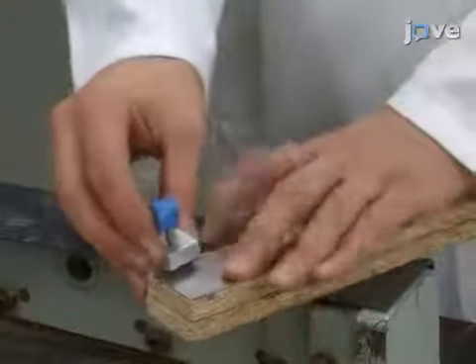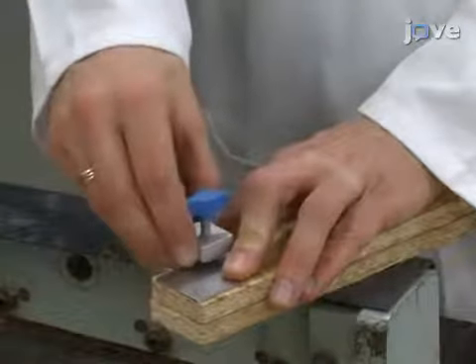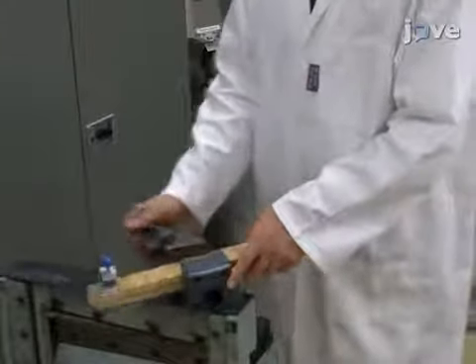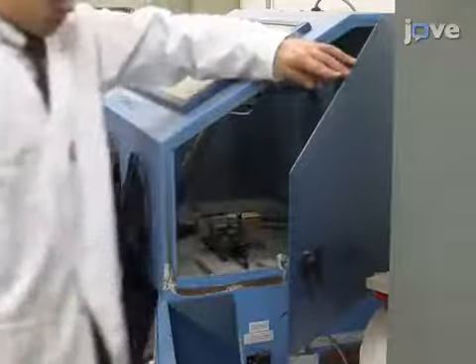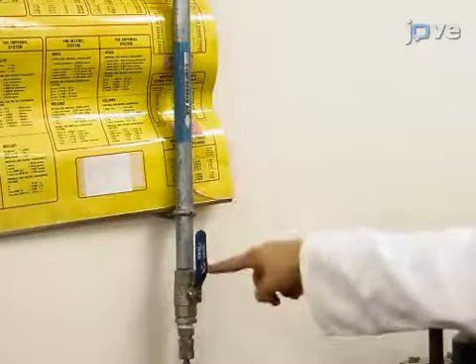Next, place the steel onto a 1 to 2 cm thick block that is slightly larger than the square sample. Use one vise to secure the sample onto the block and another to hold the sample tightly by the edge of the block during the sanding. Then, move the entire assembly into an internal blast chamber. Turn on the compressed airflow and tightly seal the chamber.